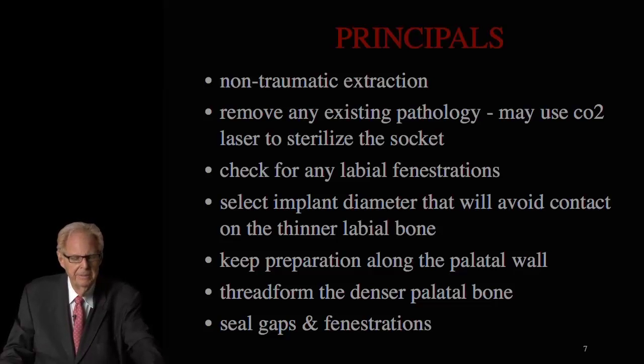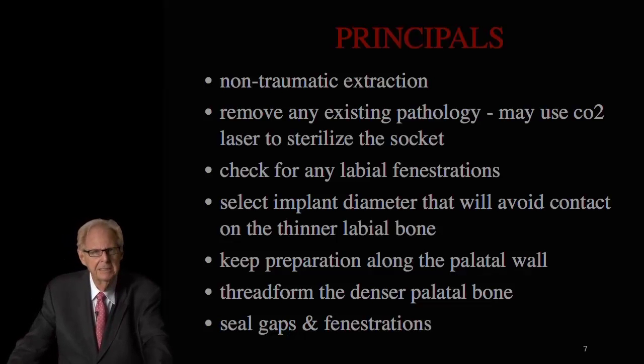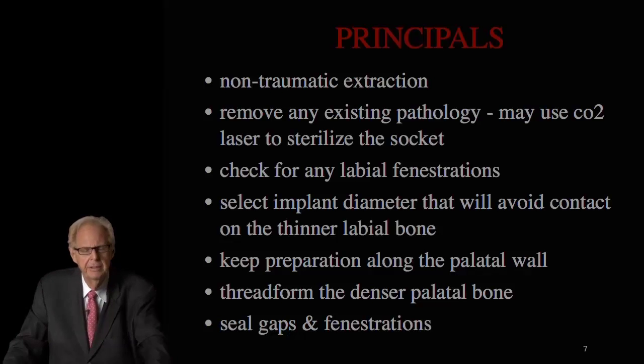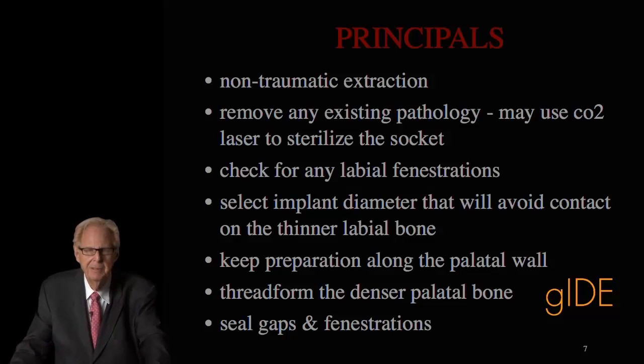Now, very important that we use the thread former if we're using a threaded type implant and not a self-tapping implant that has aggressive threads. But if we're using a tapered implant or a parallel walled implant that's basically a threaded implant, we want to be sure that we use the thread former against the palatal bone so that the implant can go in without being pushed against the labial plate.